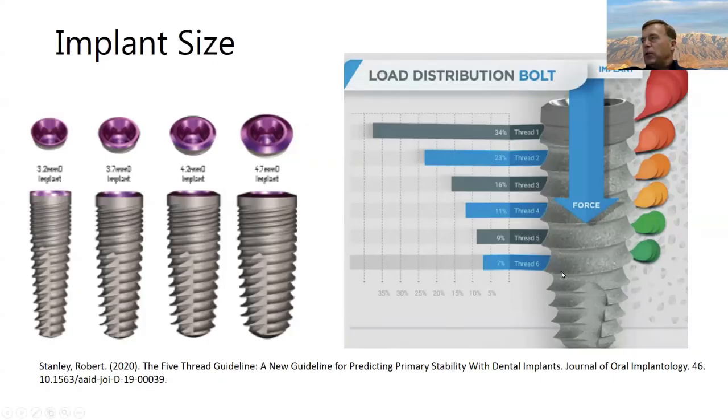The other thing that I'm sure a lot of you have heard is that after the first 10 millimeters, you're really not getting much load on the implant. This area is primarily to create stability for immediate load. So if I get a longer implant, I'm building strength in an area where I'm not going to load it anyhow. By going with a larger diameter up here where the forces are greatest, I'm getting more surface area, so less stress per square millimeter.